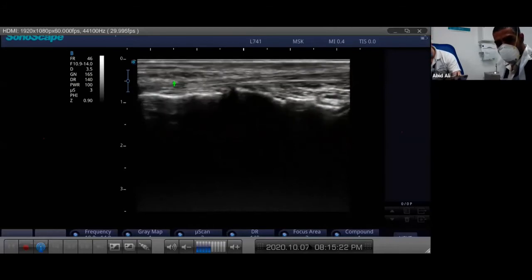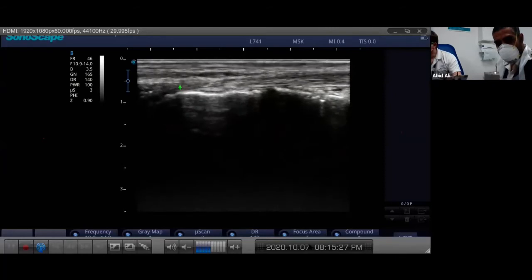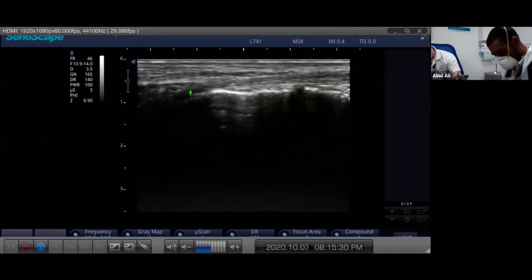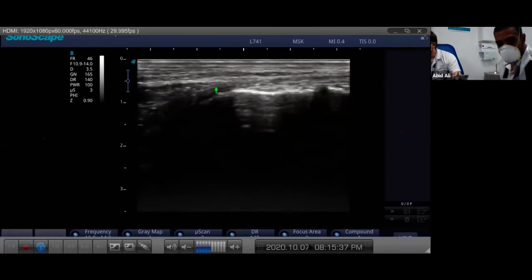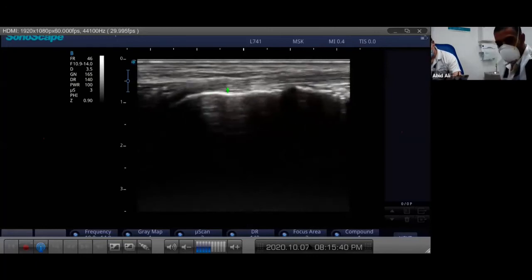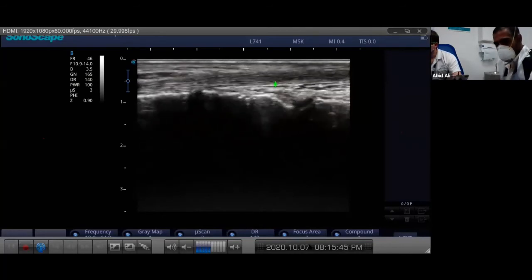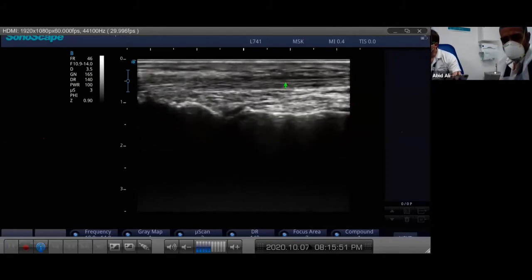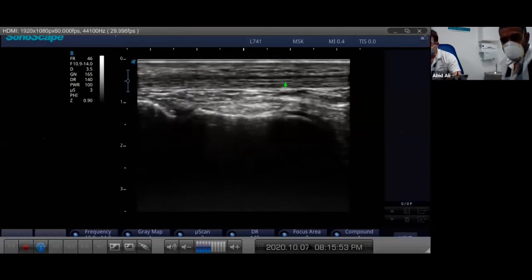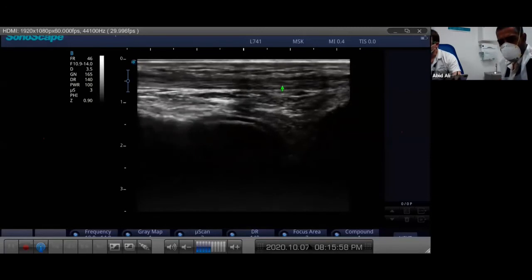You can just follow that down as it dips off to the navicular insertion. You can see we're following the tendon here - I've gone all the way to the tarsal, the probe on the left hand side is right over the first tarsometatarsal joint. So you can come back on that - that's your tibialis anterior, commonly injured. Do you see many tendinopathies there Adrian in your practice? It's probably the one you see more of the three, but not that many.